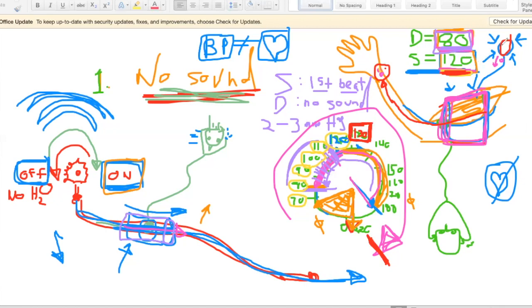And when you press the little bulb to get air into your sphygmomanometer, what you do is you pump it up to 130, which is your estimate, plus 40 extra millimeters of mercury. So for this individual, when I stop feeling the radial pulse at 130, when I'm actually going to do the blood pressure, I'm going to pump only to 170 now.